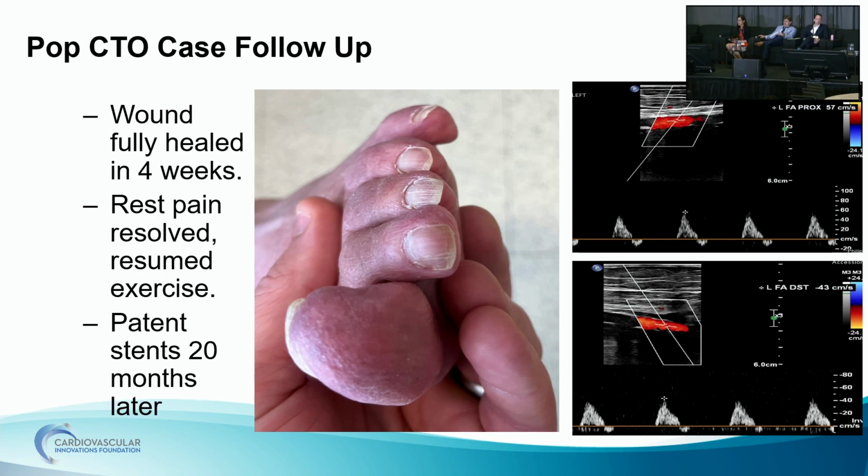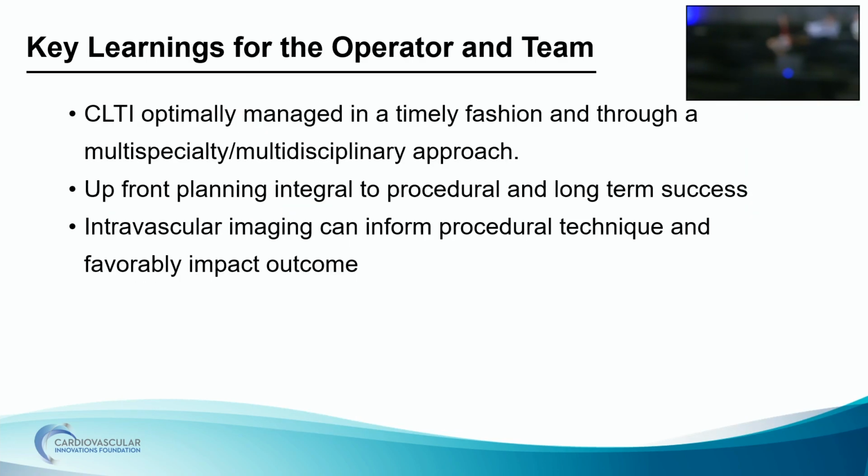So that was the end of the case. The wound healed fully in 4 weeks. The rest pain resolved, and the patient at 20-month follow-up had patent stents.